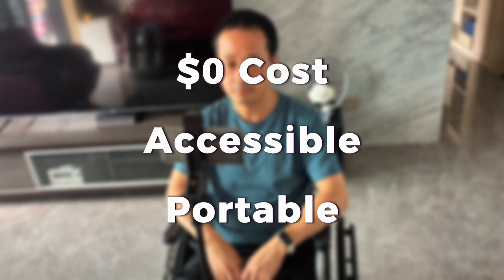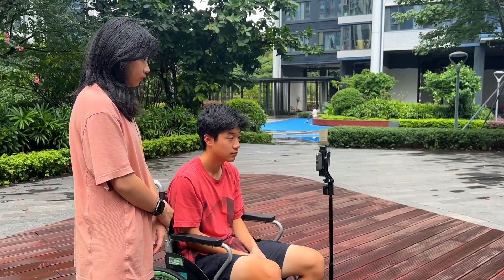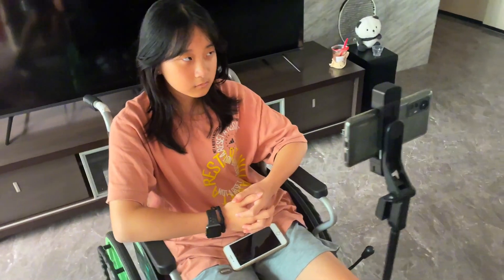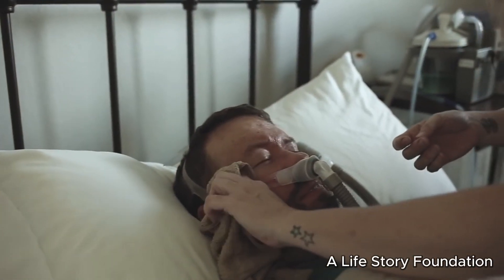GazeLink is free, accessible, and portable. It also adapts to different users, lighting, and languages. My objective with GazeLink is to give all ALS patients an equal voice in society and magnify their never-ending passion to live.